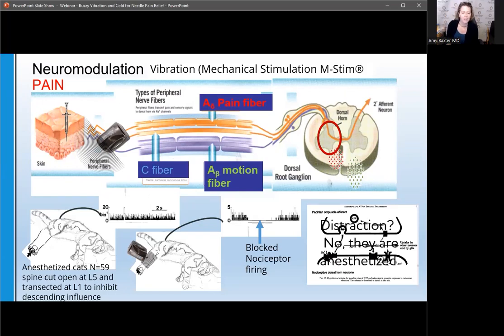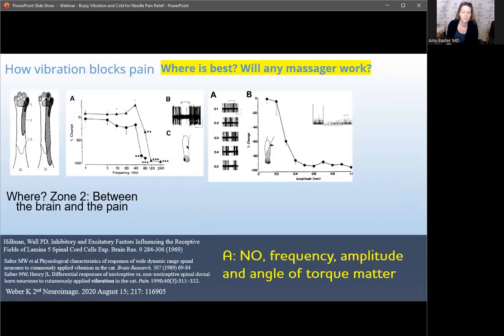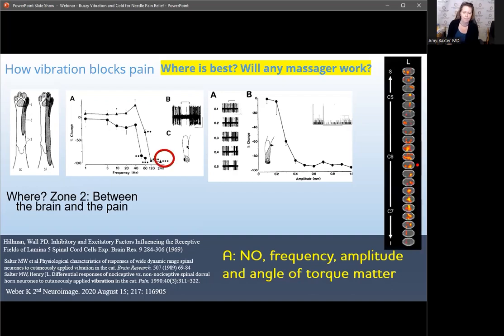So is this distraction? We get asked. No, these are anesthetized cats. And part of this research also lets us understand that any vibrator is not necessarily going to work. There's going to be a decreased effectiveness of it until you get to the right amplitude and the right orientation and the right frequency. So all of these things matter.